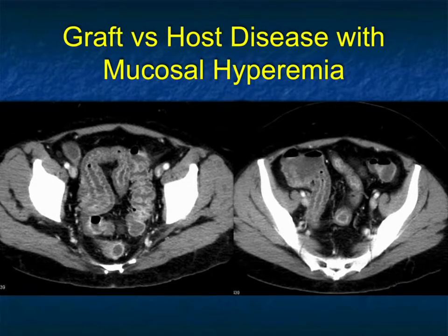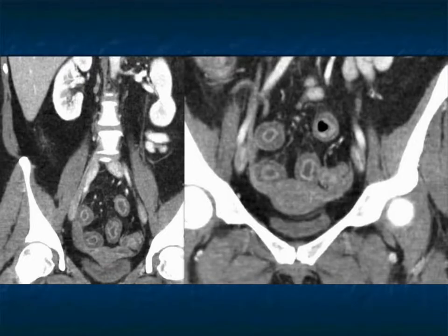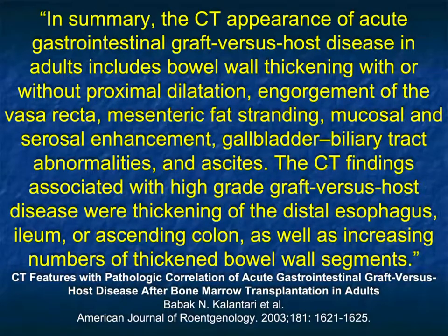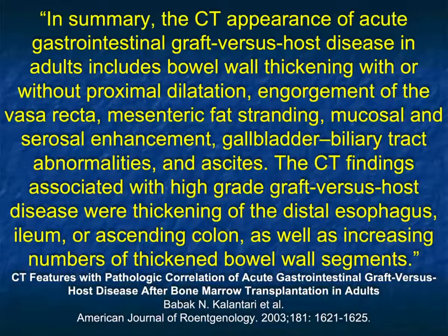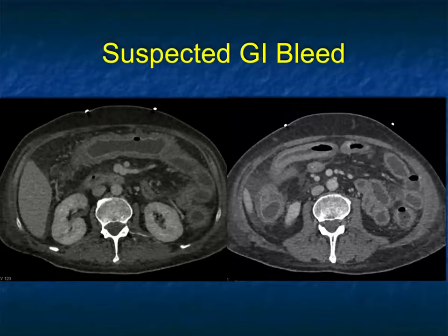Another example: look at the mucosal hyperemia, particularly impressive in graft-versus-host disease, with that cross-sectional look of small bowel. CT findings associated with high-grade graft-versus-host disease include thickening of the distal esophagus, ileum, or ascending colon, and an increasing number of thickened bowel wall segments. Findings include proximal dilatation, engorgement of the vasa recta, mesenteric fat stranding, mucosal and serosal enhancement, and ascites — long-segment involvement is the pattern.